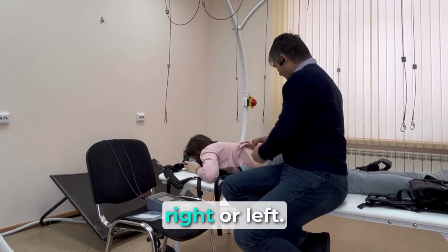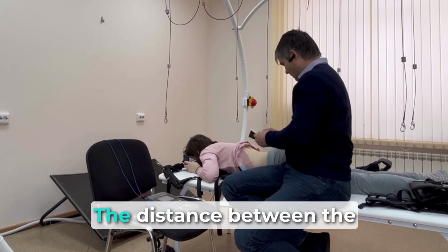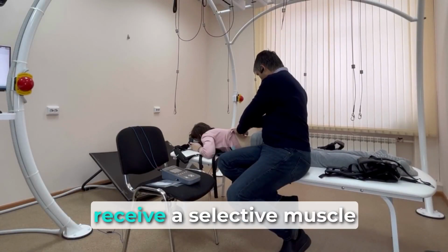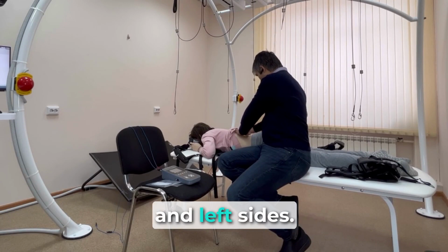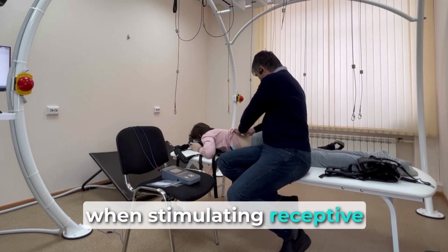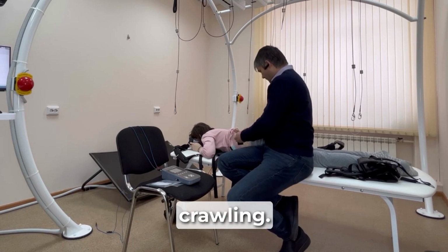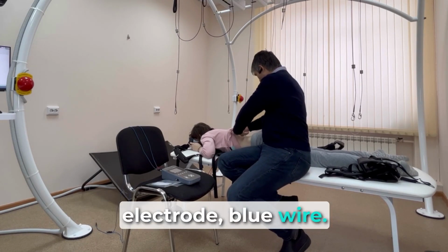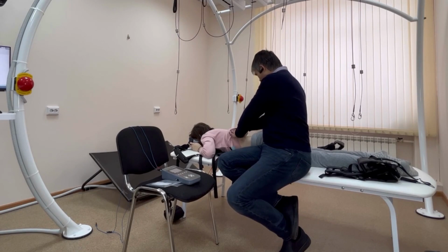We apply 2 electrodes paravertebrally on the right or left. The distance between the electrodes is approximately 1 centimeter. This makes it possible to receive a selective muscle response on the right and left sides. For example, when stimulating locomotion, such as walking, crawling. Blue color, this is the active electrode, blue wire.